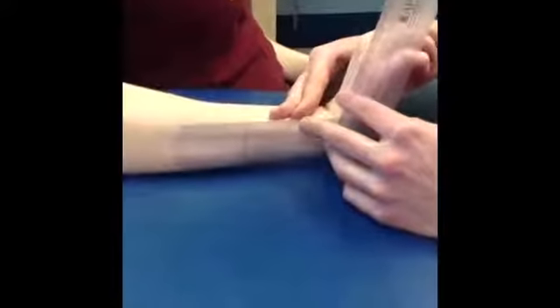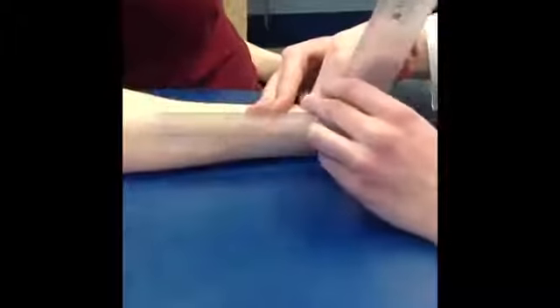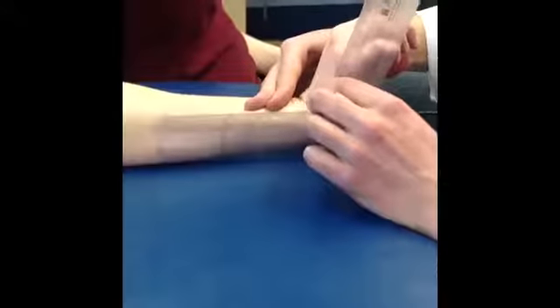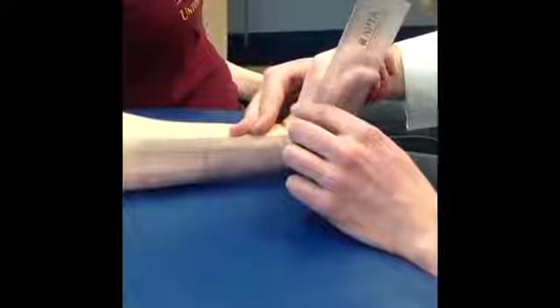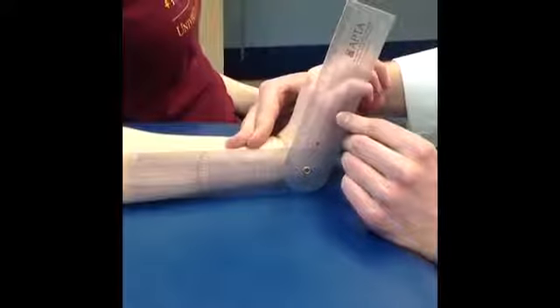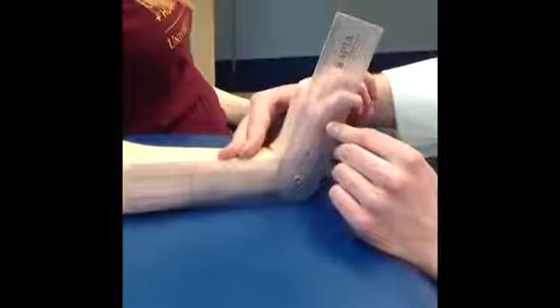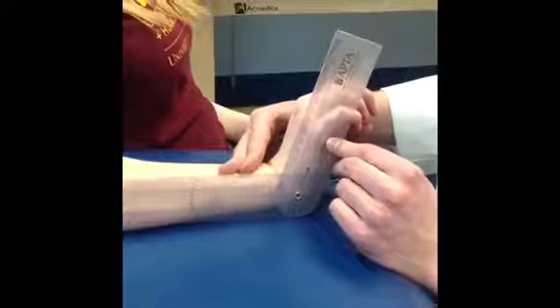As you can see, she does have a little bit more. I have to adjust that down a little bit, and line that up with the head. And I can read that from here. I've got her at 74 degrees. So she does have more passive range of motion than active range of motion. That makes sense. She might have some limited passive insufficiency or active insufficiency that would cause that. And that is goniometric assessment of wrist extension.